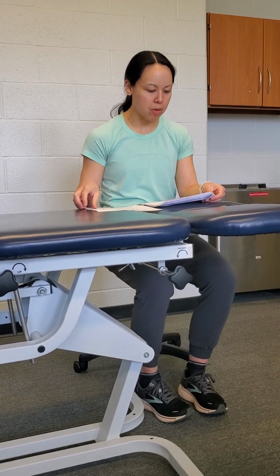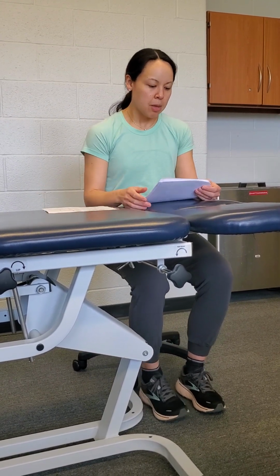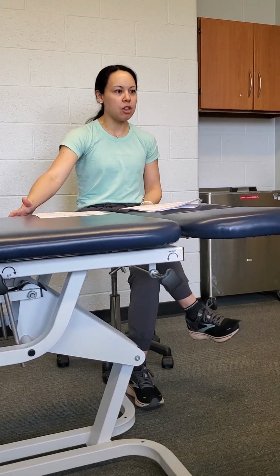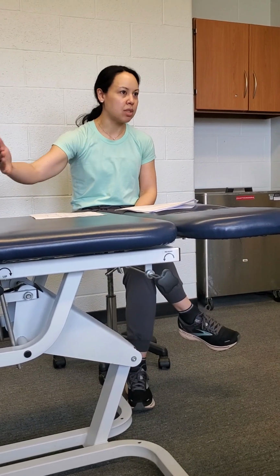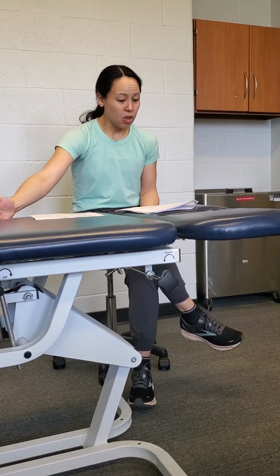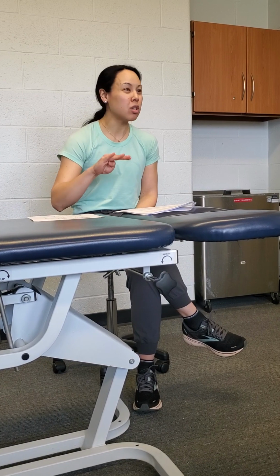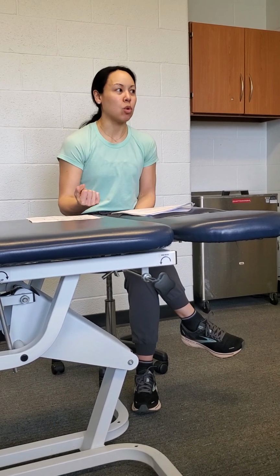Okay, so we'll just talk about the protocol. Typically the BFR protocol is 30, 15, 15, 15, meaning the first set is 30 reps and then subsequent sets are 15 repetitions. The goal is to go through those 4 sets, and the 4th set is either 15 reps or to fatigue. So if they hit fatigue at the 10th rep, or at the 5th rep, they're done that set.